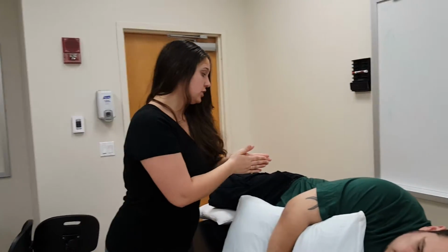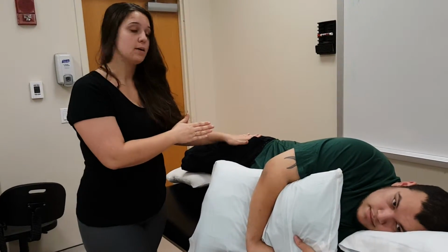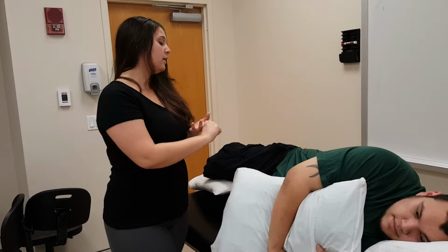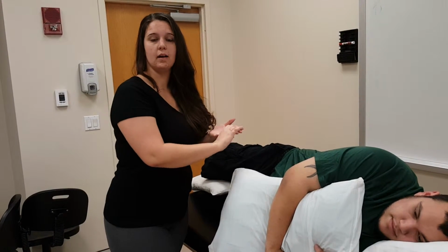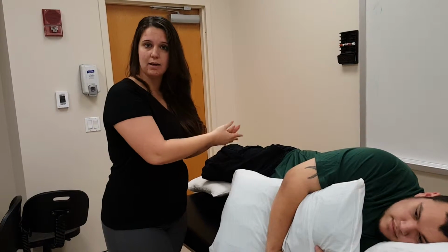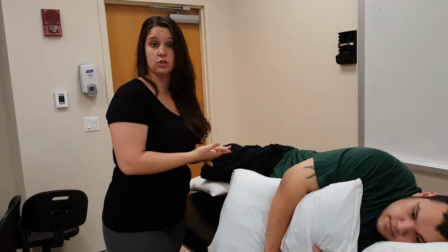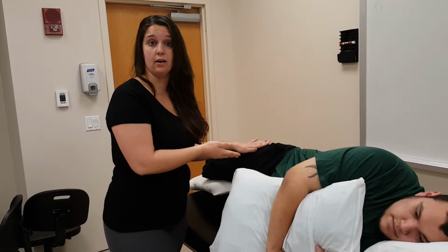Previously, I checked the area on my patient's hip where I'm going to be applying it to make sure there wasn't any open wound, there's not any metal in the area, either from his belt or anything like that, or any sort of implanted metal that potentially could be dangerous if it heated. And I also checked to make sure that he had sensation in that area.